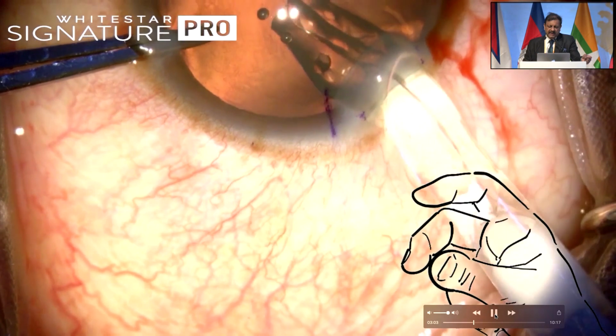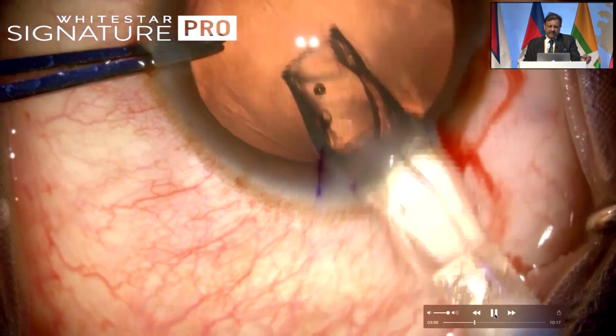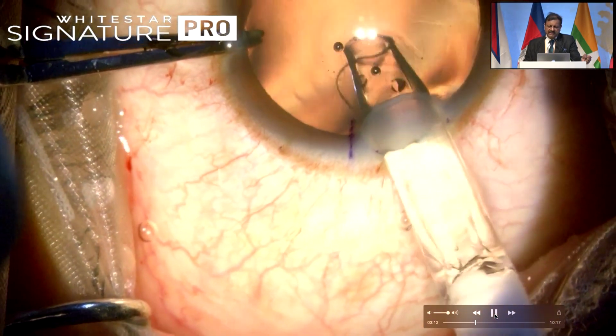So never be in a haste, just watch. The lens goes 1/4, but then you can't push in. Withdraw the lens, reload, and then you can re-inject the lens.